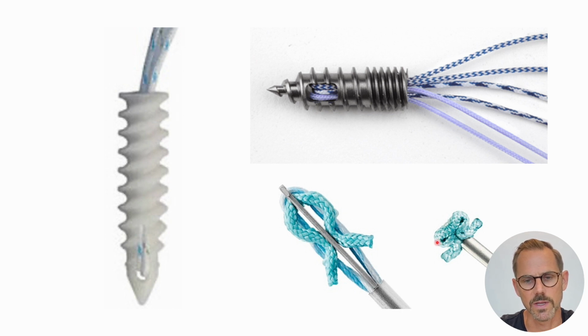So you place the sutures within the bone, and then they expand once they're in place. So the result of that is that you nowadays usually cannot see the anchors on plain X-ray, so maybe that's even a bigger place for us sonographers because of that phenomenon. But important to know when you work with imaging of the post-op shoulder.